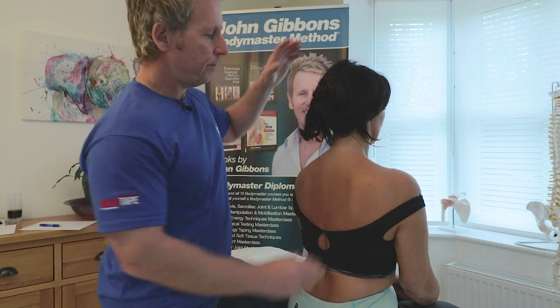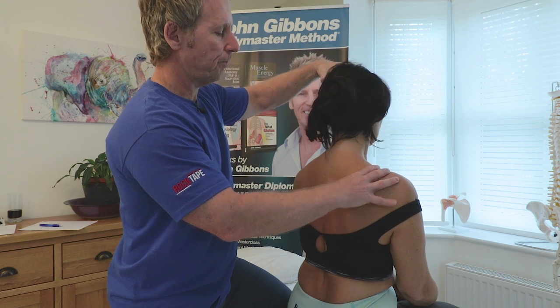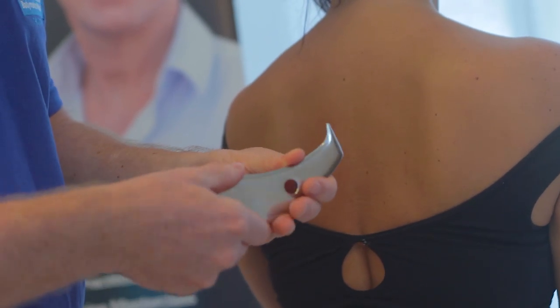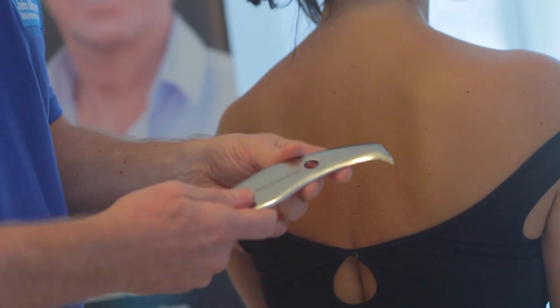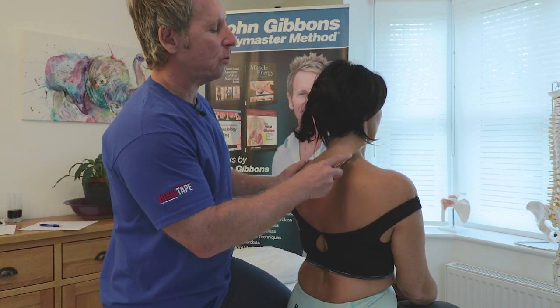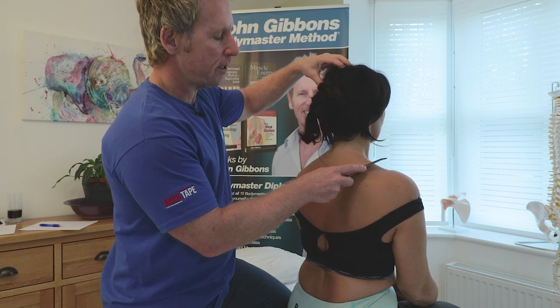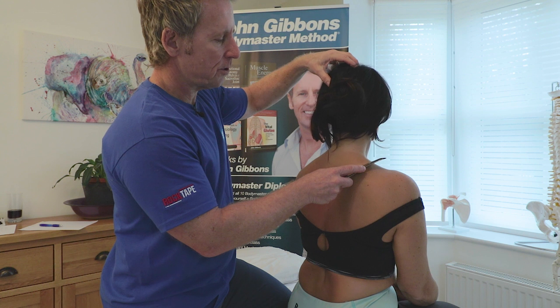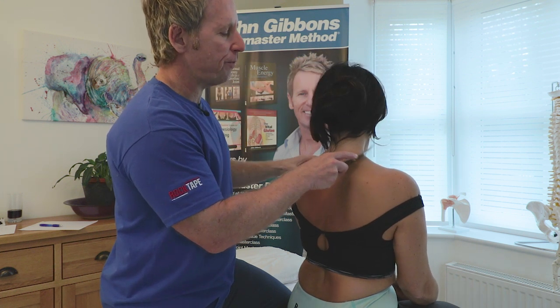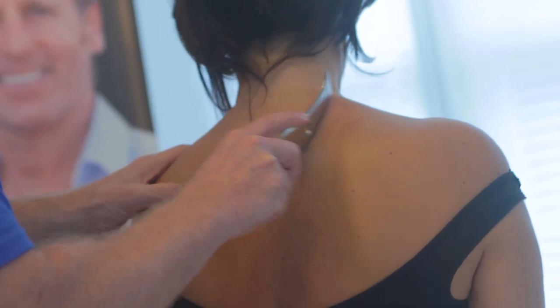Every movement we do, the patient is going to move. So to start, they are going to rotate and then slowly bring the chin down. On the tool we've got different edges — we have a slightly wider edge here and a narrower edge. Start with the wider edge to see how it feels. As they slowly rotate and bring the chin down, we can actually work both ways. In reality you'll probably find it easier to work as the tissue is lengthening.